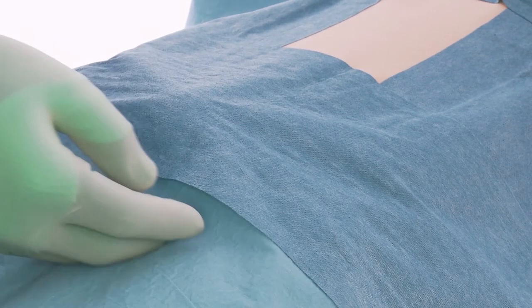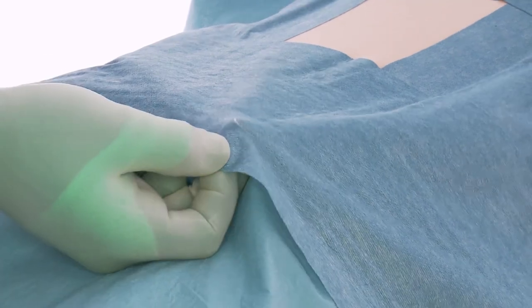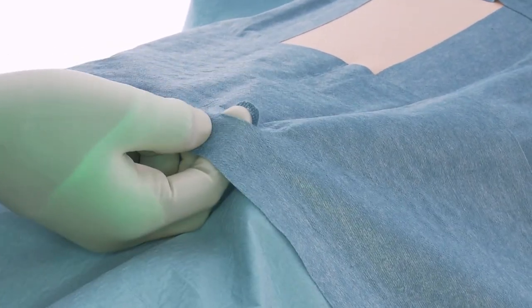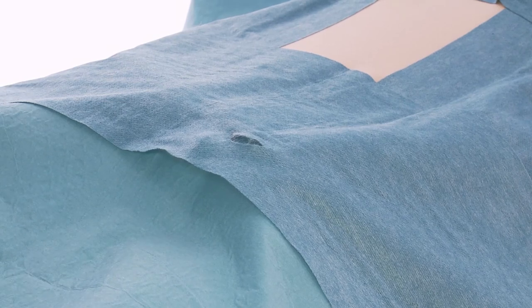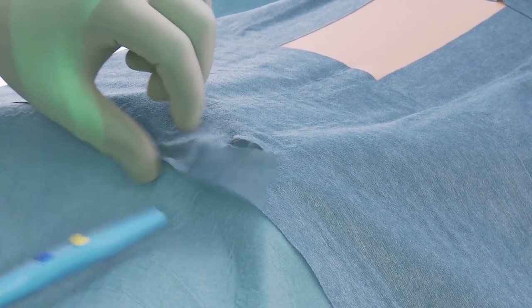Use the integrated tube holders for fixing tubing and cables. The patch area around the surgical site is for extra strength and absorption.